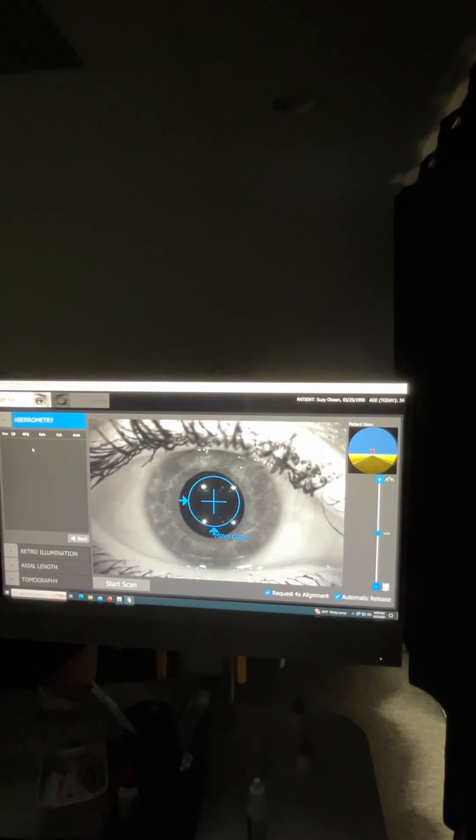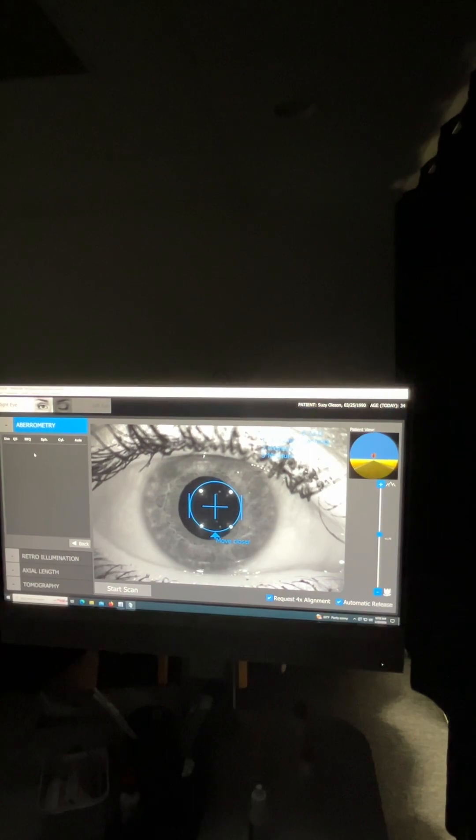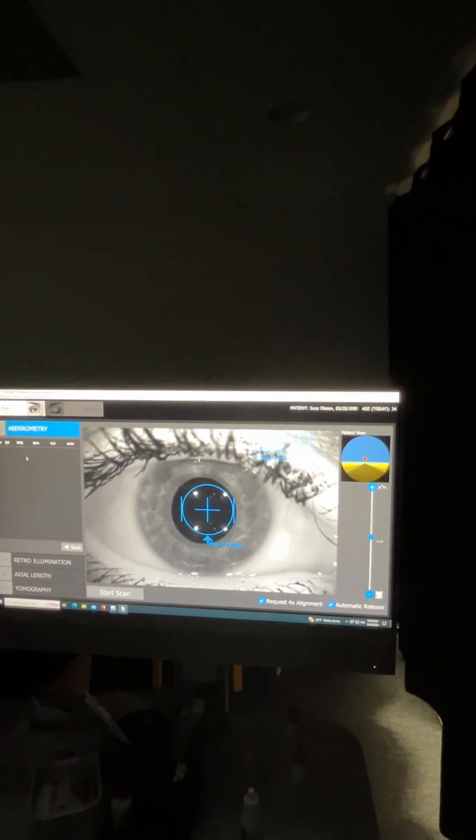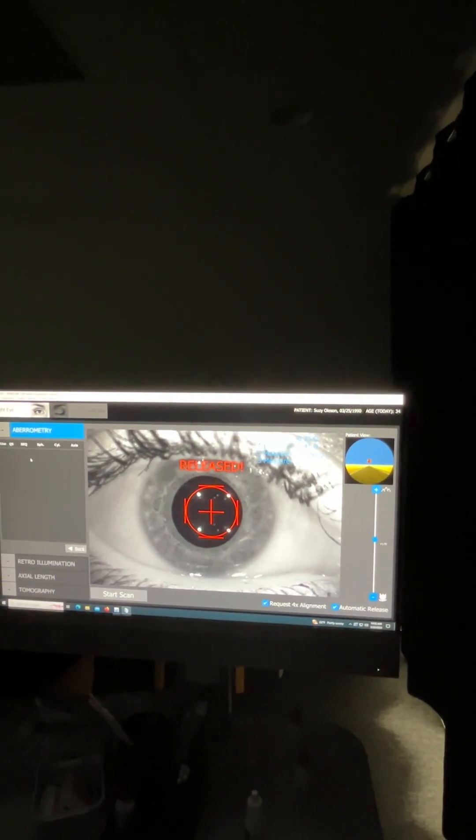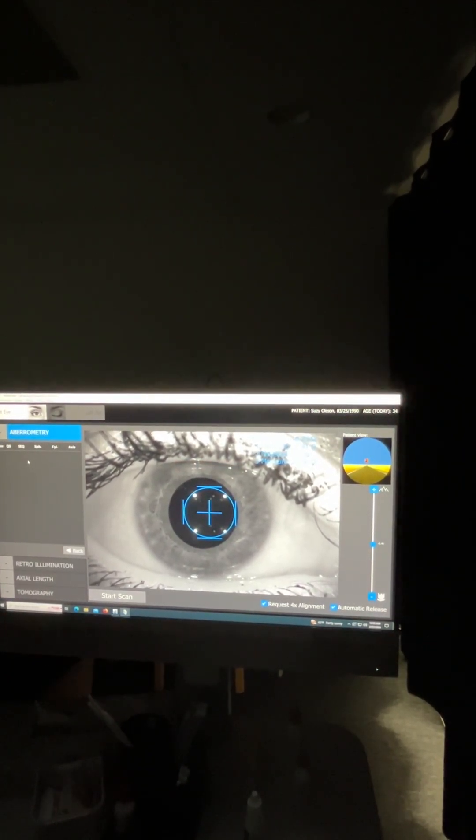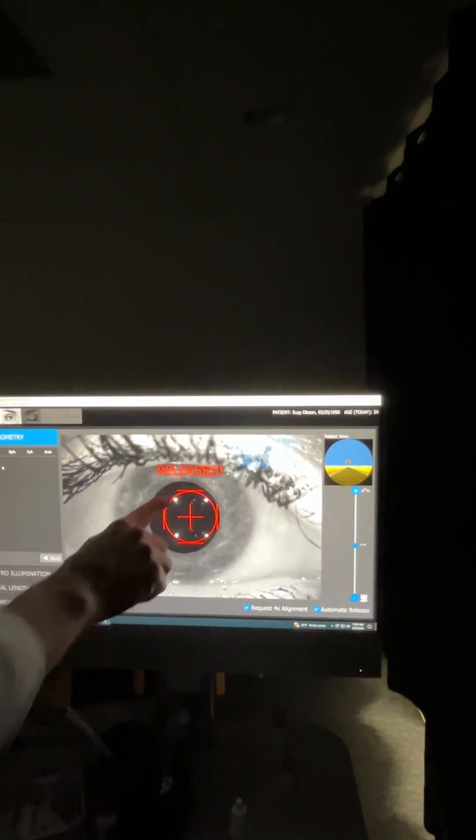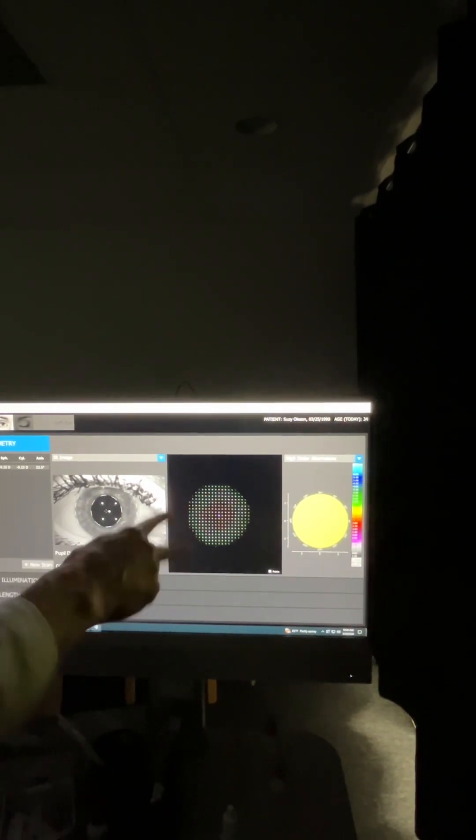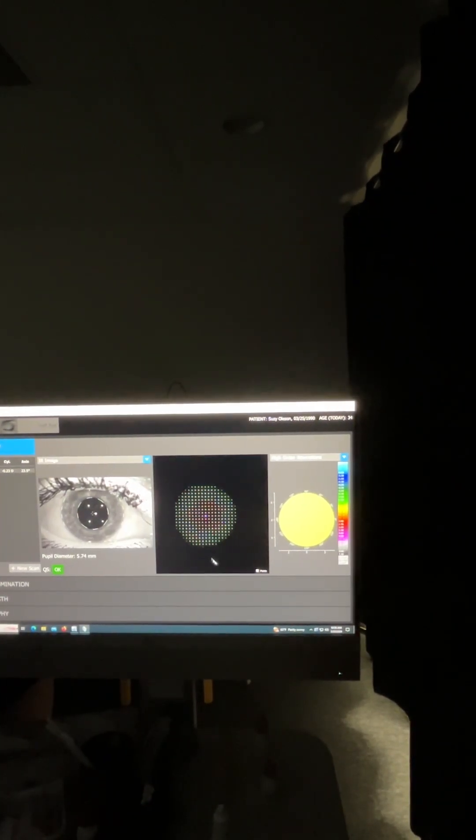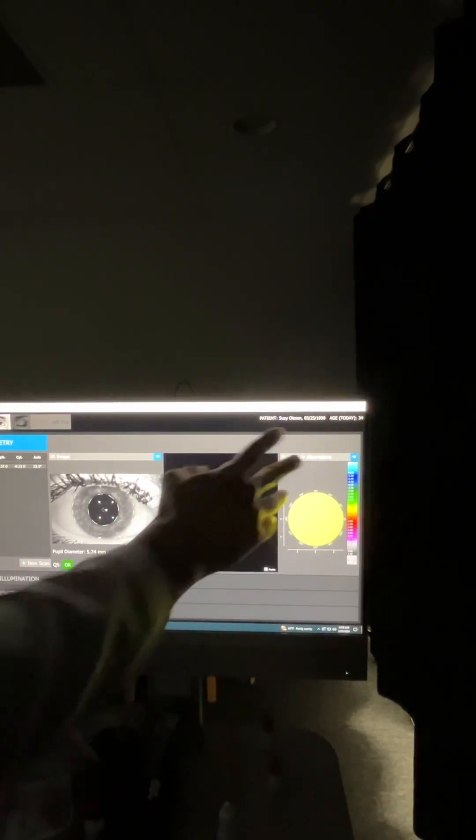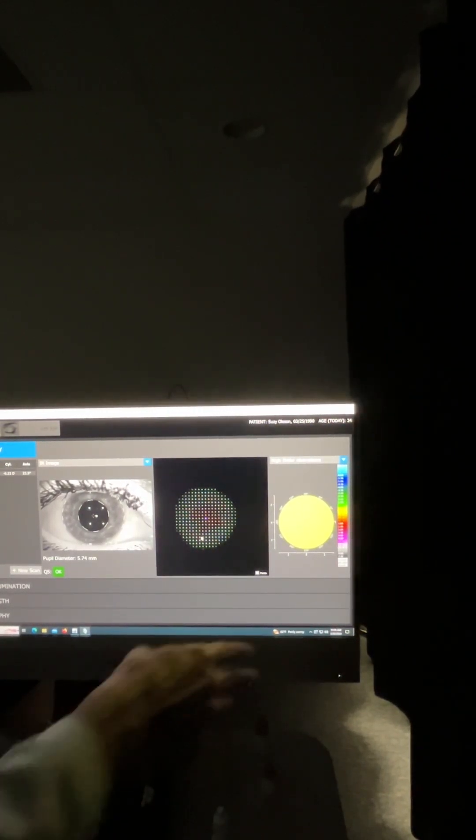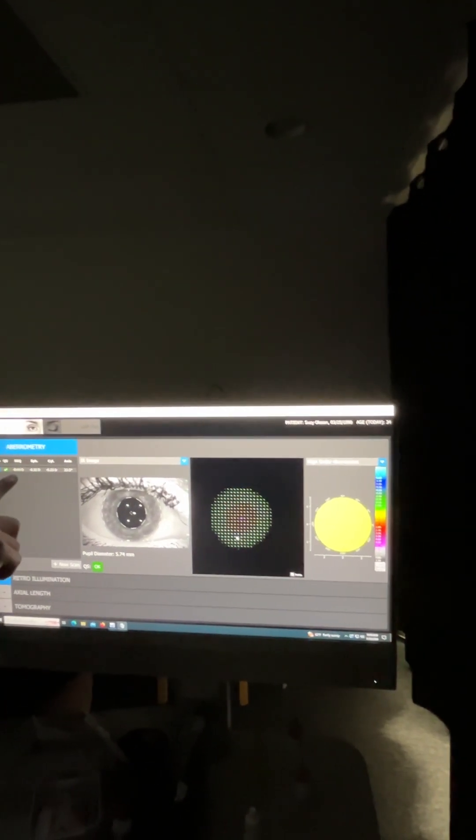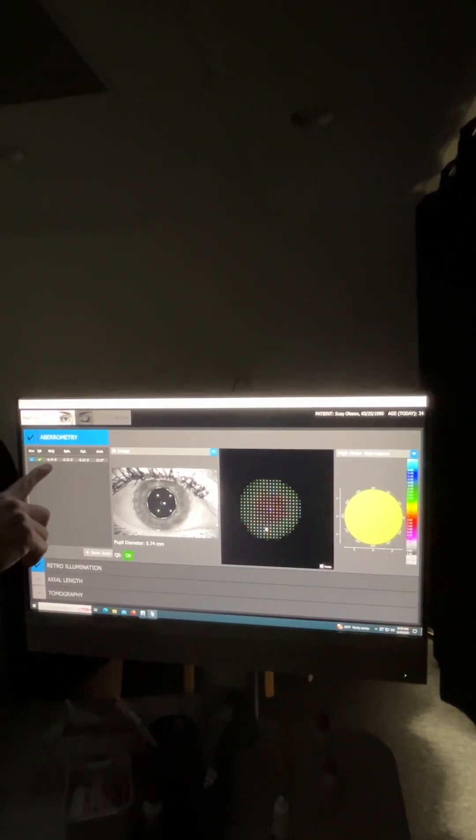So Susie, you'll see the hot air balloon. Just let it do its thing. It'll be blurry and clear. You'll see that the instrument will also tell you if you need to push in or pull back out. It's very sensitive though, so it's very small movements, but you'll see where it's got the four blue bars or four blue lines around the blue circle. That's what allows the instrument to capture when you have all four of those. Once it does so, it's going to give you your Shack-Hartmann aberrometry, which is basically all these little dots are from the lenslets within the Shack-Hartmann aberrometry. It will process that and then it'll give you a wavefront map, a higher order wavefront map. Now in this display, ultimately she doesn't have really hardly any aberrations. So it's going to be essentially one color, but people that have higher aberrations will get more variety in color. Prescription is listed here. So it'll give you a spherical equivalent, which is really nice, especially from a general contact lens standpoint, or maybe you're going to use this to put into a visual field instrument. And then also it'll give you the more precise spherical cylinder and axis.